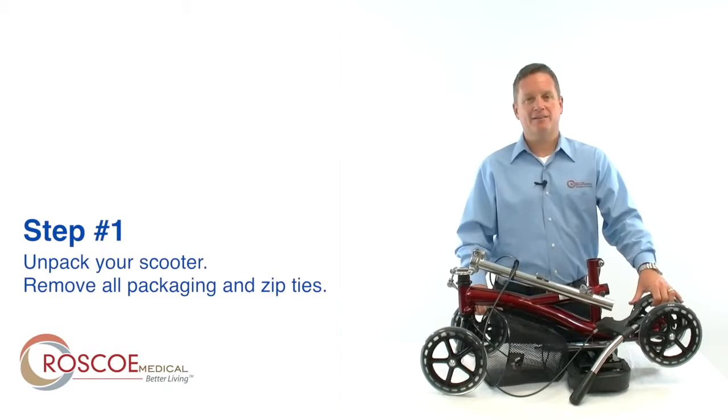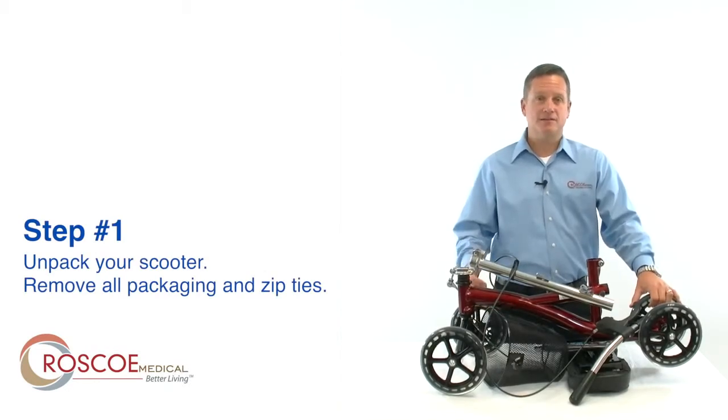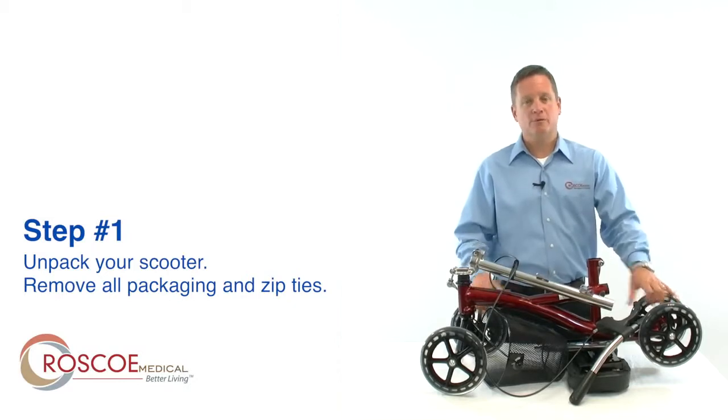Step 1: unpack the Knee Scooter from the box and remove all the packaging and zip ties. For demonstration purposes, we have already removed those.